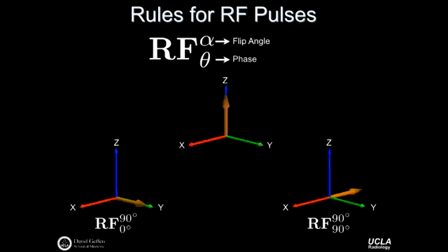All right, let's talk about the second free parameter here. It was the phase. By convention, I usually write things this way. I put the axis of rotation along the bottom here. So in the Lauterbur book, sometimes he puts an X or a Y down there. More generally, I just call it theta. So that's a little bit of a difference from the book itself.